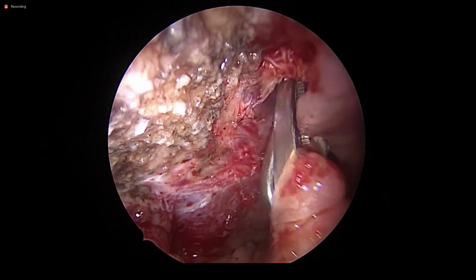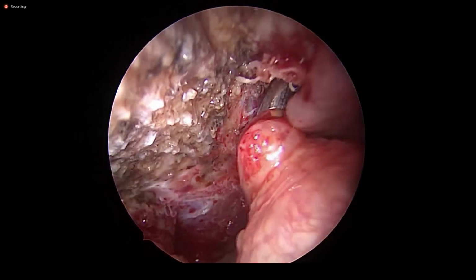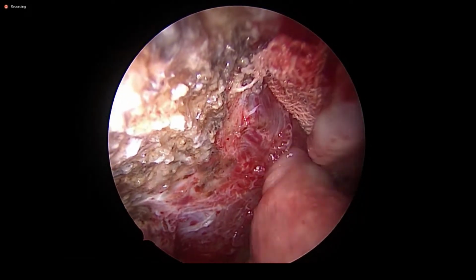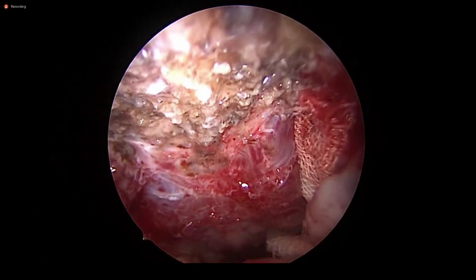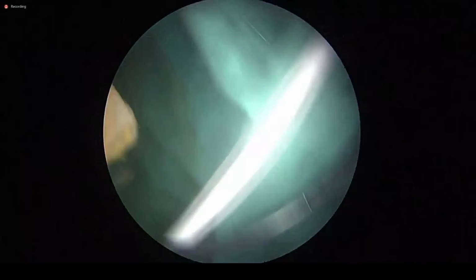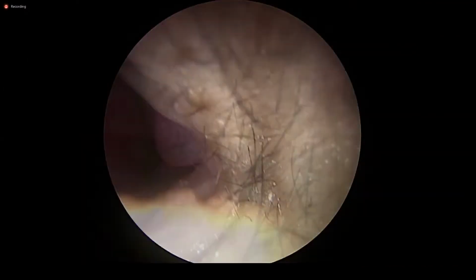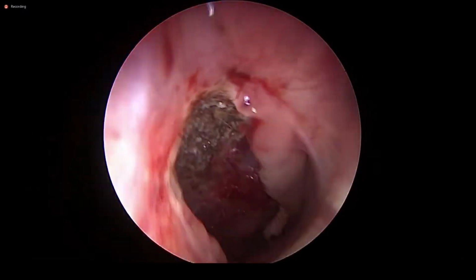I can leave on an adrenaline sponge for a while. We go to the opposite side. I hope it is very clear. It's very clear. Now going 30 degrees, now 45. Now going to the opposite side. Same way, like we did, we'll remove from the opposite side, and you will find, see this, from the nasal cavity.